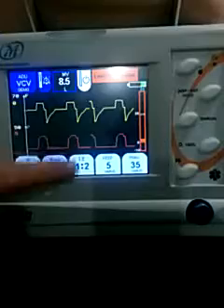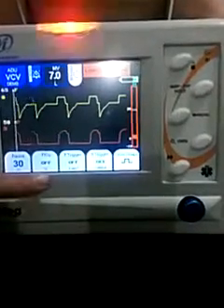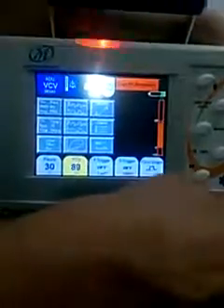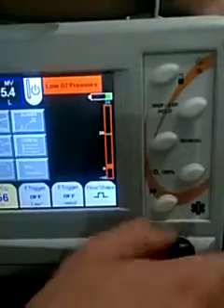Here we have frequency, IE ratio, PEEP, pressure maximum, inspiratory pause, FiO2, flow trigger, pressure trigger, and flow shape. The FiO2 is adjustable from 35%, the minimum is 35, up to 100. Of course, you can go one by one, step by step, until you reach 100.